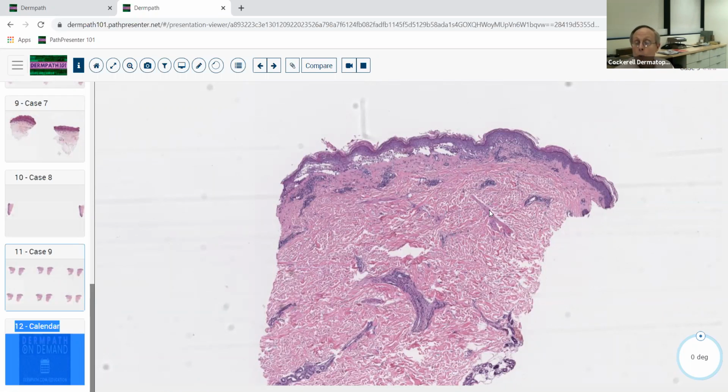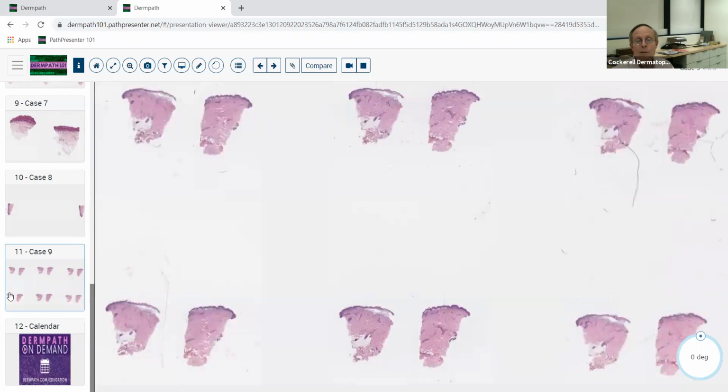Now, we don't know when we're looking at this whether the patient's going to have mucous membrane involvement or not, but most of the time when they get this degree of epidermal necrosis, they usually do have mucosal involvement. So these are the ones where we do get a little concerned. Is this patient possibly going to go ahead and slough large areas of their skin? Are they going to get involved with their eyes and other mucous membrane sites? So again, you want to not be cavalier when you're dealing with erythema multiforme.